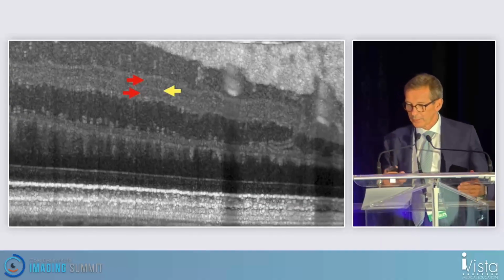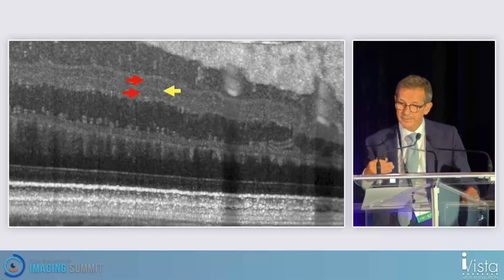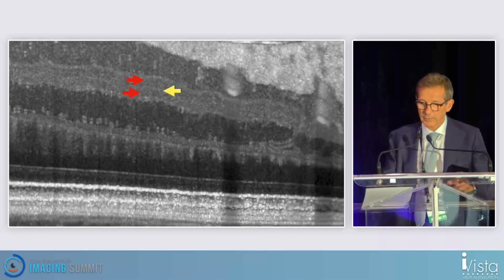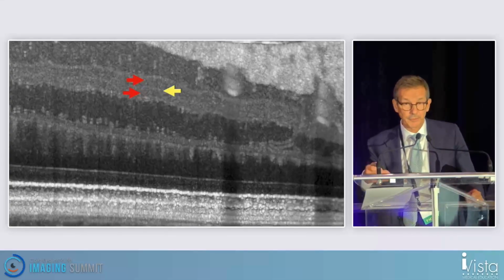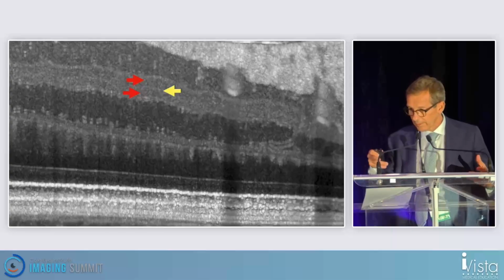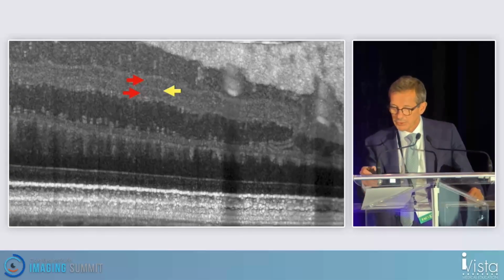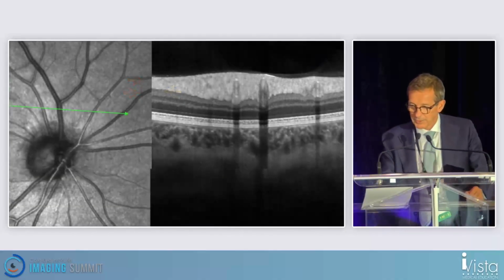And just to let you know, if you look at the histology, you can actually understand where the bipolar cells on and off are. And this seems to be quite correlated, for example, with some schizophrenia. It seems that it has some changes at that level, so it would be interesting also for use in oculomics, such a layer that usually we are not able to differentiate.